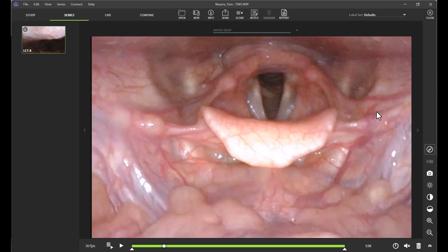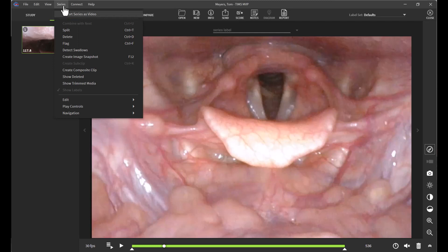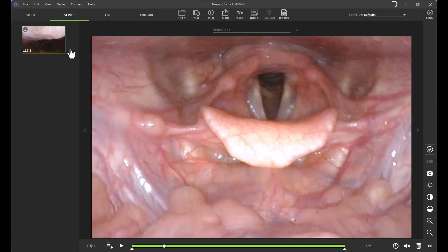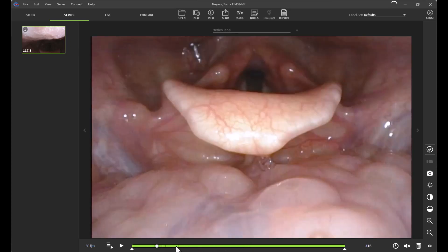To begin, I will draw your attention to the toolbar at the top part of the screen. If you click on the Series tab as shown and click on Detect Swallows, you'll notice that along my green timeline here on the bottom part of the screen, there are small gray ticks appearing. These small gray lines are indicative of a swallow occurrence.